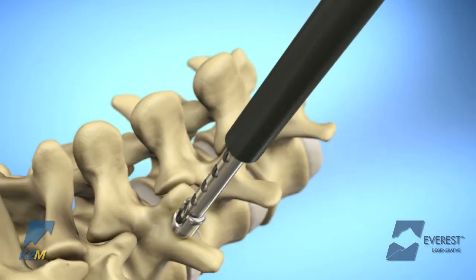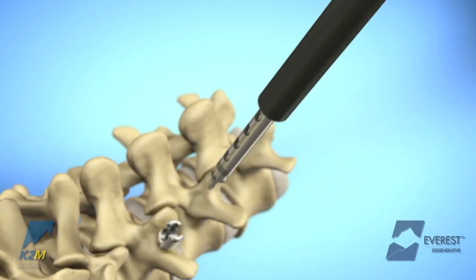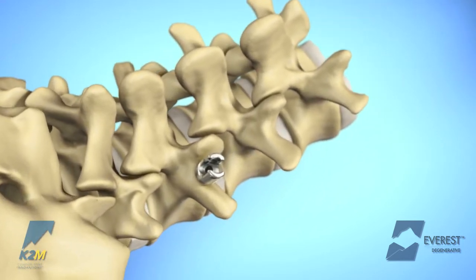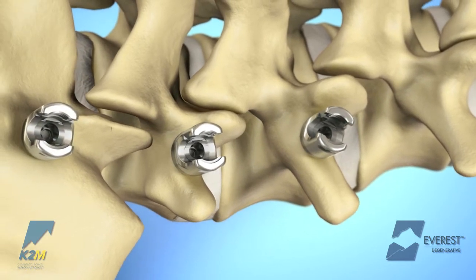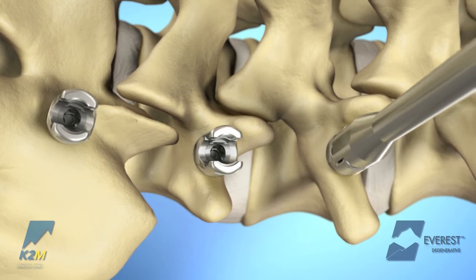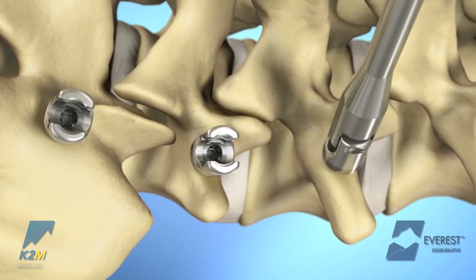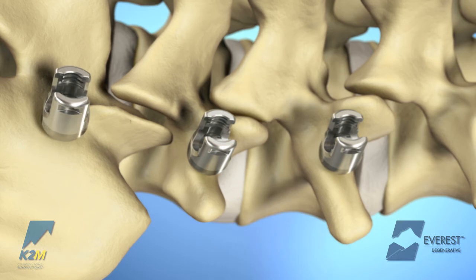To disengage the screw inserter, gently turn the knurled wheel in a counter-clockwise direction and remove from the surgical field. Once the screws have been advanced to the appropriate depth, it may be necessary to realign the implant heads prior to rod insertion. The polyaxial housing of the screw can be manipulated with the screw head adjuster.